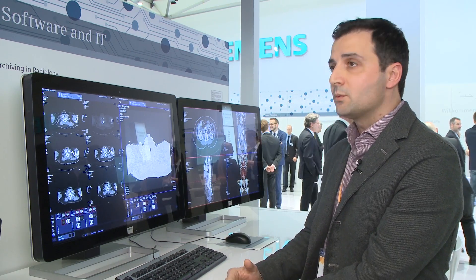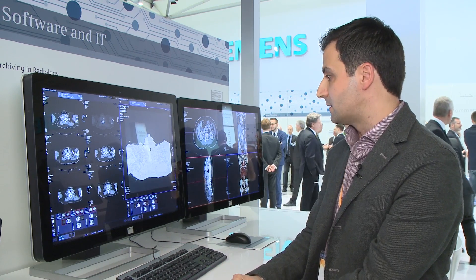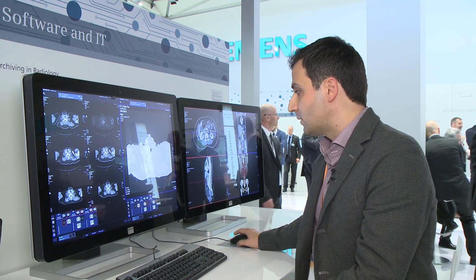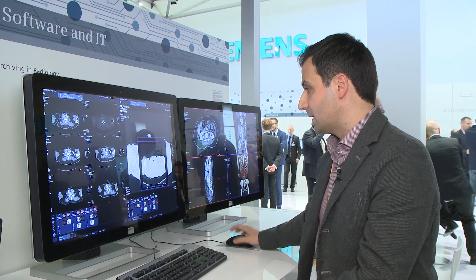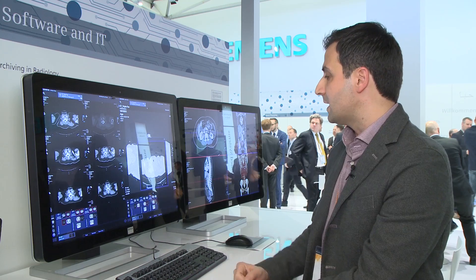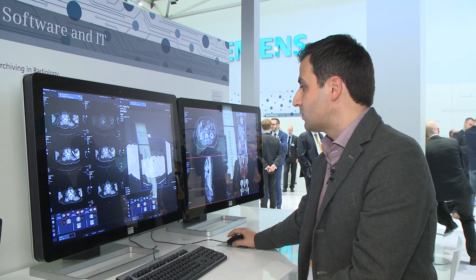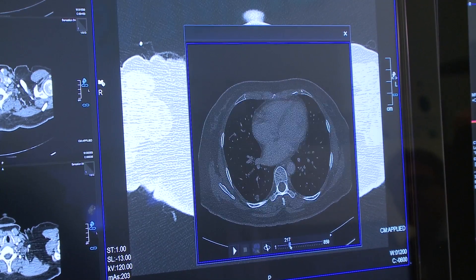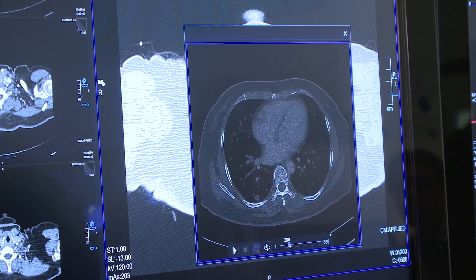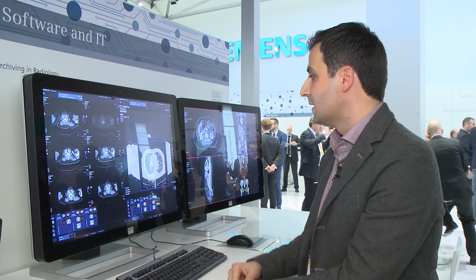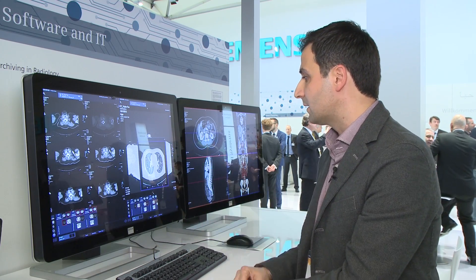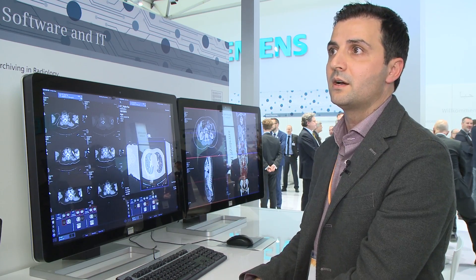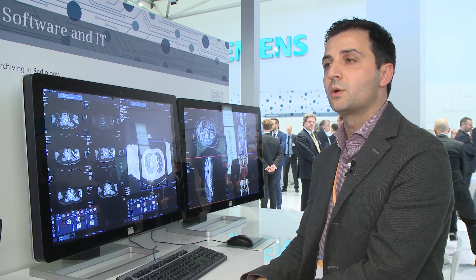The second one I would like to mention is the Token View. You can navigate within a data set very rapidly, and it saves a lot of time. You don't have to load the pictures — you just double-click the image data set and you can find the pathology that you are looking for.